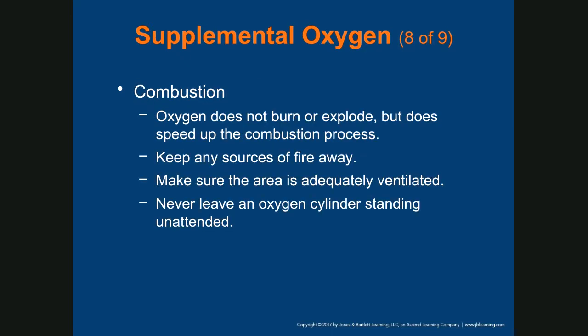Now, combustion. Oxygen does not burn or explode, but it does speed up the combustion process. Keep any sources of fire away. Make sure the area is adequately ventilated. Never leave an oxygen cylinder standing unattended. And you shouldn't have that type of cylinder in the field. You should have a small cylinder that can go on your stretcher.